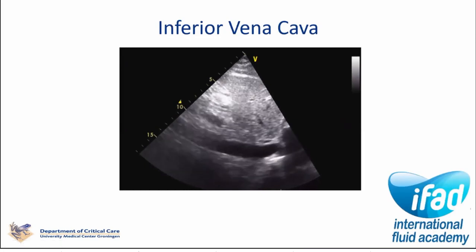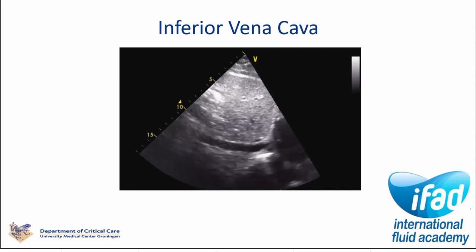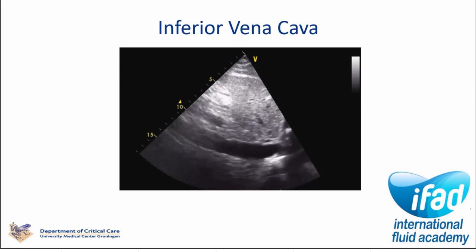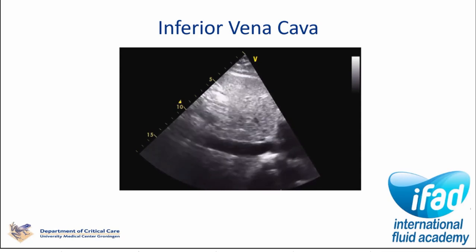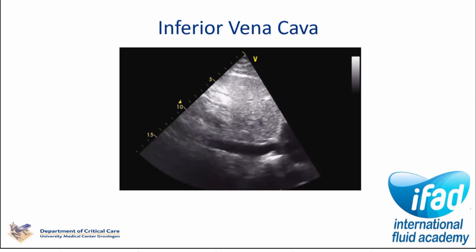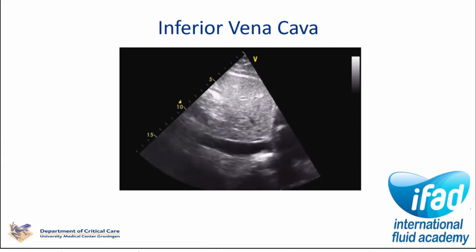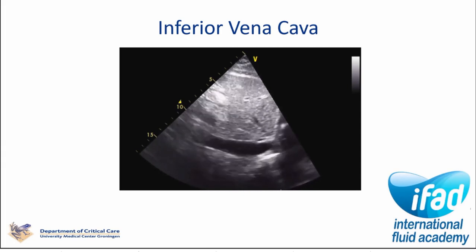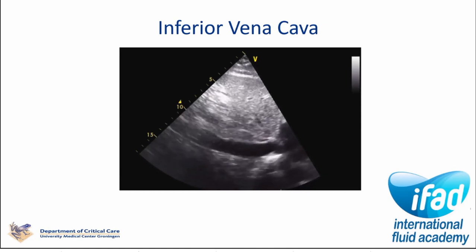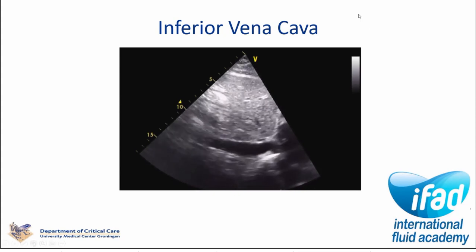Another thing which can be shown using ultrasound is the inferior vena cava. It is important to note that this is sometimes difficult in ICU patients, as these are often being ventilated, which also raises intrathoracic pressure. It's also very important to identify the inferior vena cava on two planes to make sure that you have the right vessel. But if and when you do, you can see whether the inferior vena cava collapses, i.e. when there is space still to collapse for it, because this is normal. And if it doesn't, this may be a sign of venous congestion as well.